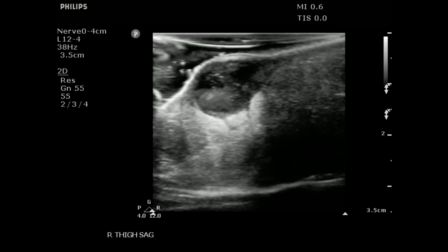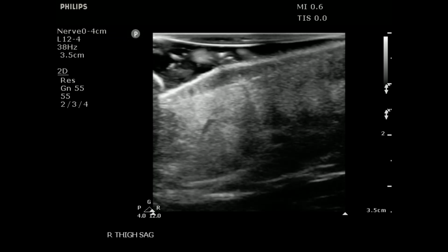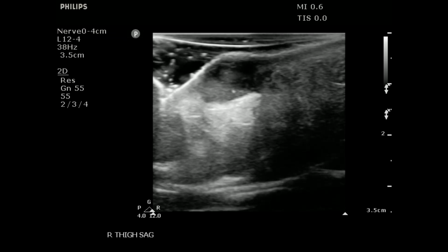Here's another example of an abscess. I'll make that one go live, but you can just see a very soft or superficial subcutaneous lesion in that area. Hypoechoic, seems ovoid, it's just one small pocket. We can easily get to that with a scalpel and some forceps and we're done, right? And so that's an example of how ultrasound can help us out, not only knowing that it's there, but procedure planning as well.